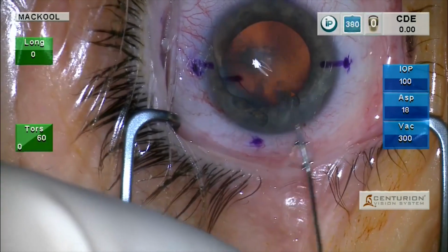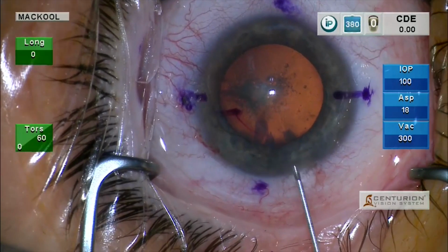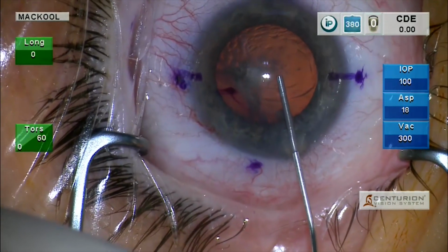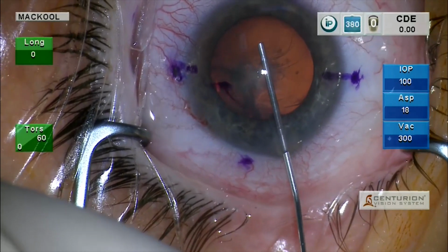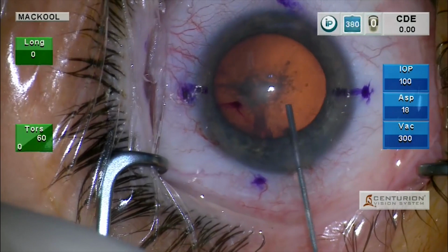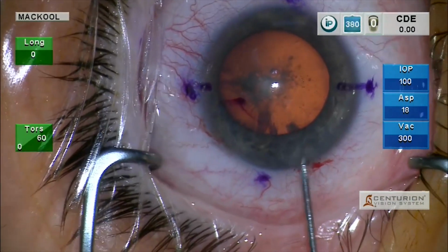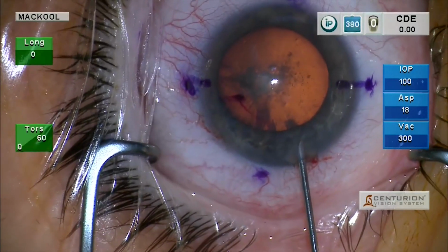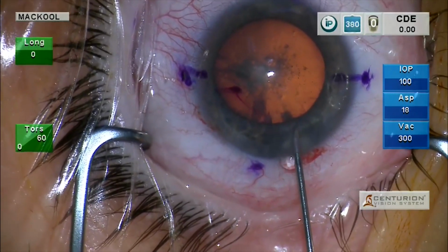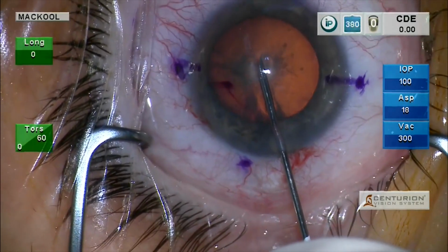And the next step is to inject the viscoelastic. And most surgeons probably use a viscoelastic such as Viscoat, a so-called dispersive viscoelastic, to coat the endothelium. And that's followed by the cohesive viscoelastic, hyaluronic acid based. And before you go in, you might want to inject just a little to make sure there are no air bubbles. And then you go in. More about air bubbles in a minute.